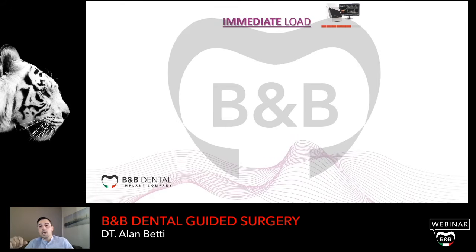This is a case of immediate load. We did this in collaboration with a doctor who collaborates with us, just to show you that with guided surgery it's possible to do a lot of things, also an immediate load, in a very easy way from the radiological stage to the surgery and subsequent prosthesis in a few days.